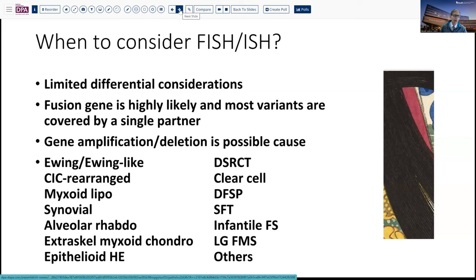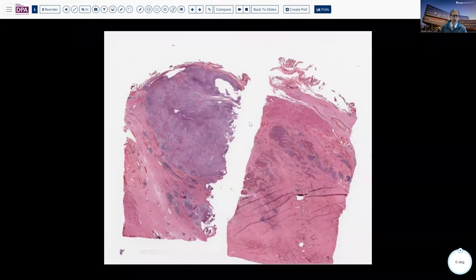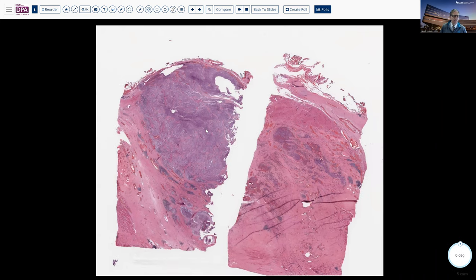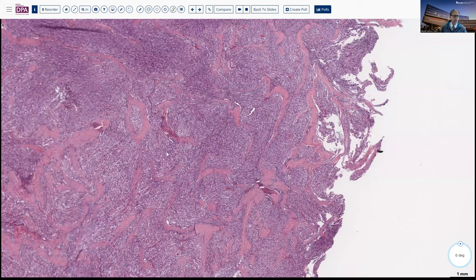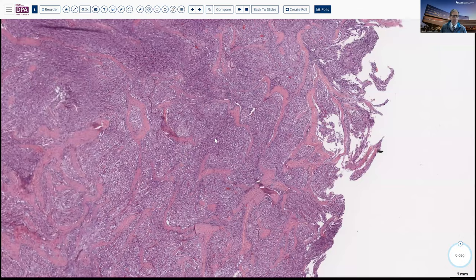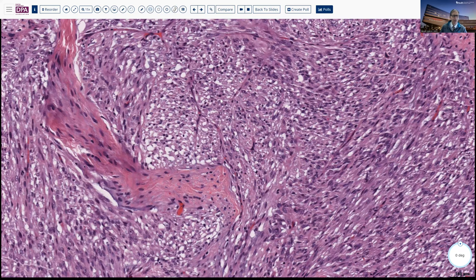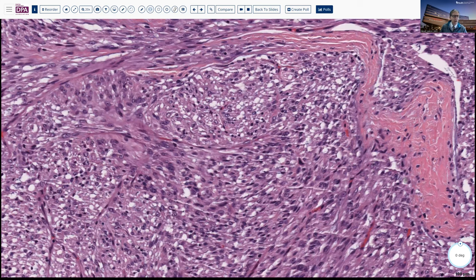So as we go forward into the case, let's take a look at the digital slide. This is a sort of deep soft tissue fascial tumor. We have some skeletal muscle down here, some fat up here. And we can see a nodular pattern of growth with some peripheral extension, a little bit of fibrous banding in between these nodules. As we come into higher magnification, we have a fair bit of streaming in these cell clusters with lots of small clear spaces. Some of these have a little bit of red cells within them, although that's not a uniform feature. The nuclei here are fairly atypical, not highly pleomorphic, but certainly mitotically active with prominent nucleoli.